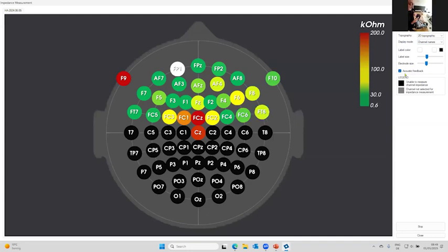As you see over here, we bundled all the wires into a single bundle, just like you have seen in the picture that I have shown for the passive electrodes, so that part is safe. We don't want wires to be affected by the TMS pulse.